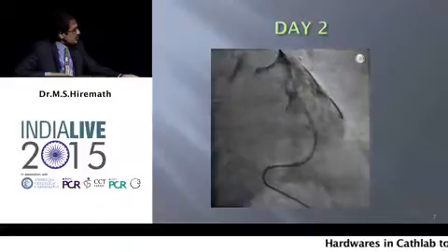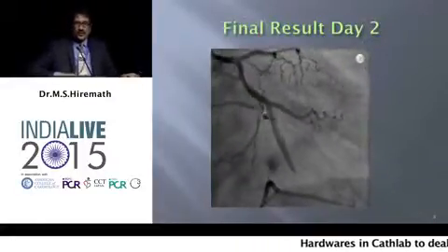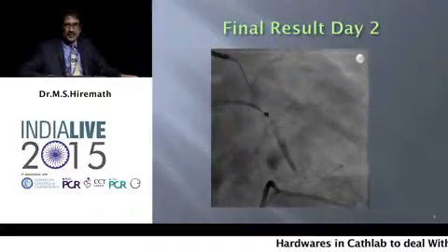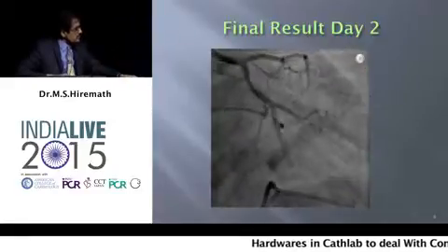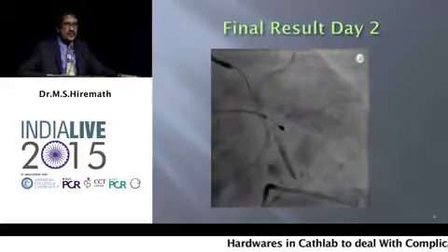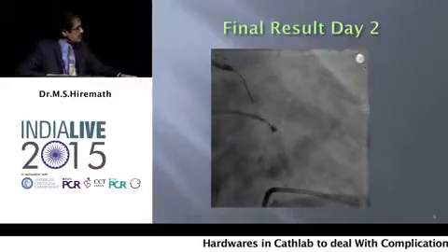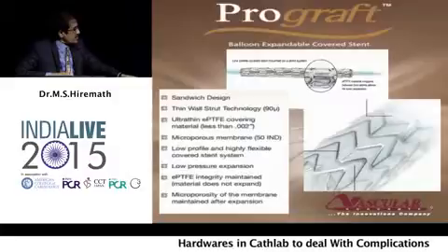finally, we had to put in a covered stent in this particular area. So taking covered stent was probably not required on day one, but my own feeling is whatever clot had sealed the perforation got dislodged with Clexane. So this is one issue. Even if you are 24 hours and more away from the perforation, no anticoagulation till the patient is discharged.